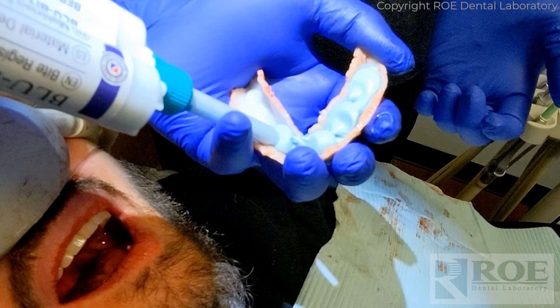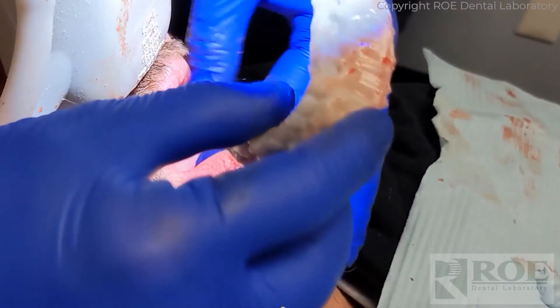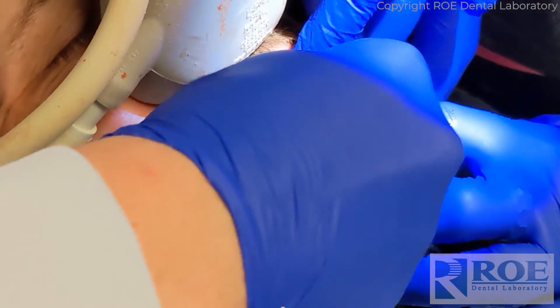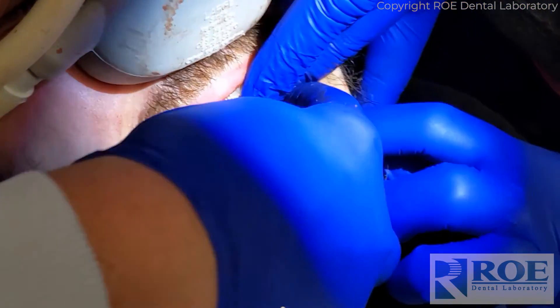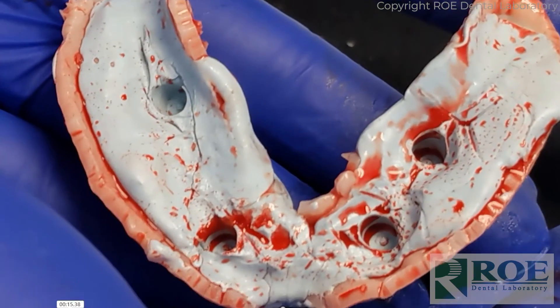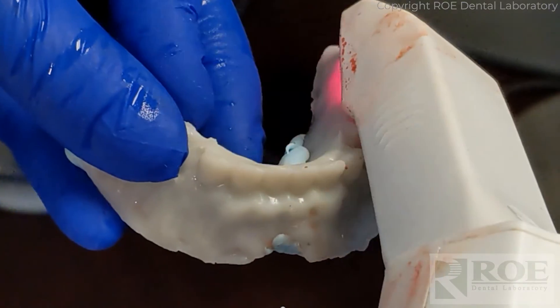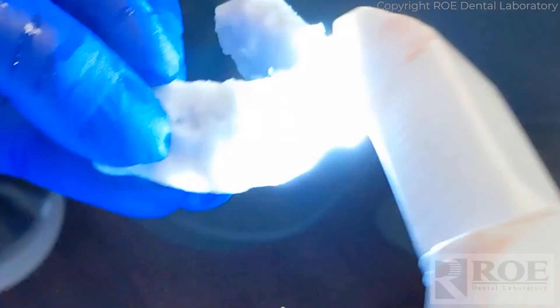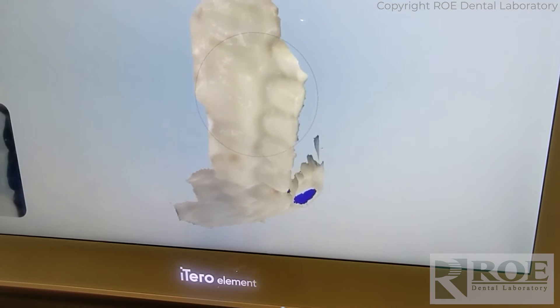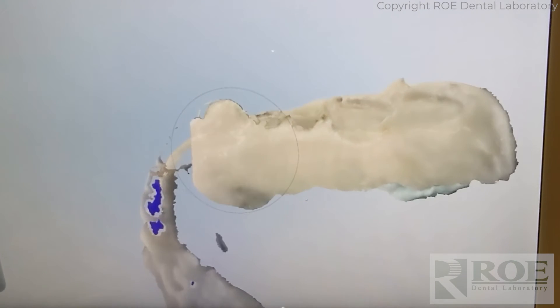Here's an interesting twist: we take that custom tray and load it with blue moose. The patient's upper existing denture is in, and then the lower denture is basically seated, relined into place, and held at bite for 30 seconds. That's what it looks like — you can see inside here are the negatives of the scan bodies. So we captured them and also captured the tissue. If the digital impression the doctor took was not perfect, you can simply scan the denture and the intaglio, which is really like scanning the mouth. Using an iTero Element scanner — which doesn't scan dentures very well, but when loaded with blue moose, it scanned just fine. It was a very nice scan.